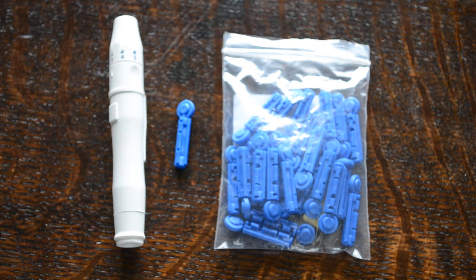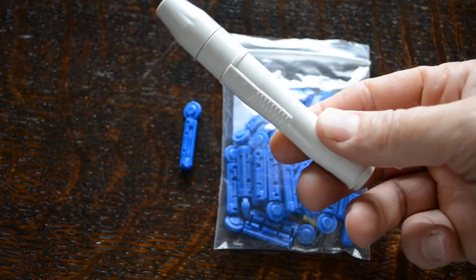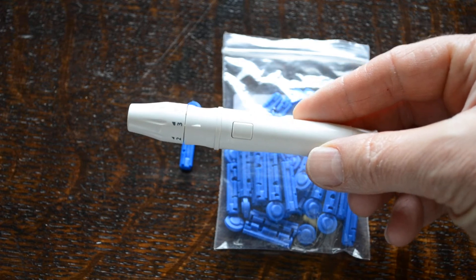In this brief demonstration video we're going to show you how to set up and use an auto-lancing device. This particular auto-lancing device is one that's supplied in our EasyLife meter systems.